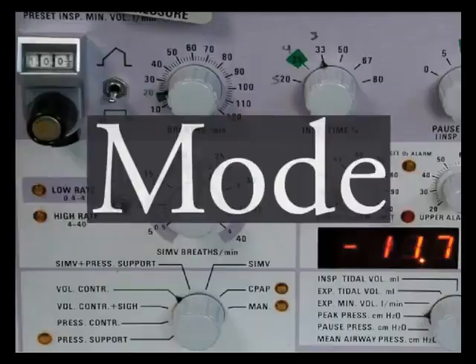So what's your mode? Your mode is assist control, volume, just like normal. Most common standard mode in North American EDs. I assume the rest of the world as well. Don't mess with it. There's plenty of really interesting modes. There's plenty of modes I use on an everyday basis. You don't need them. They're only theoretically of benefit compared to this. Stick with assist control volume unless you know what you're doing.